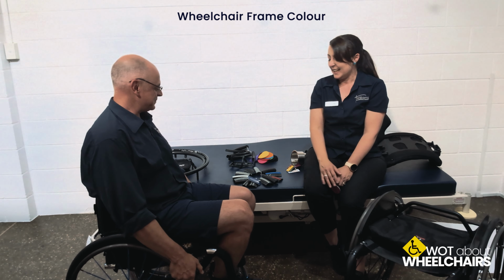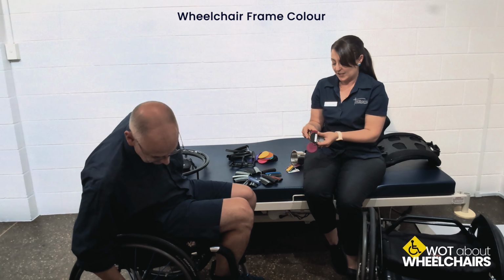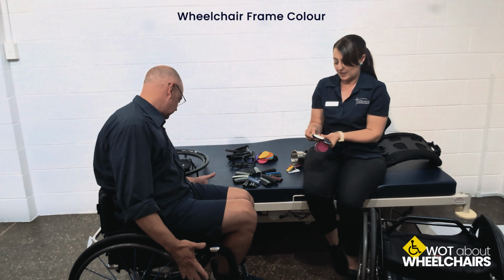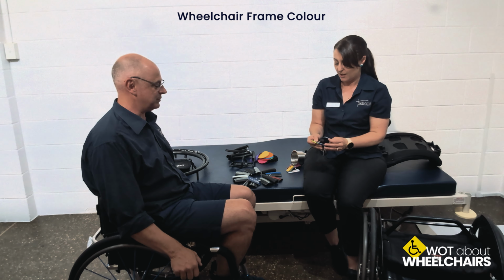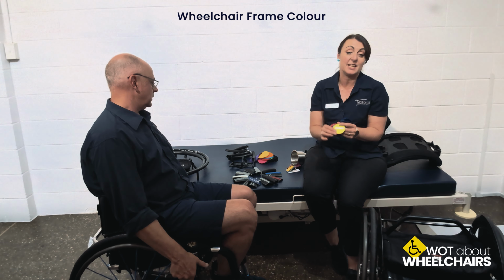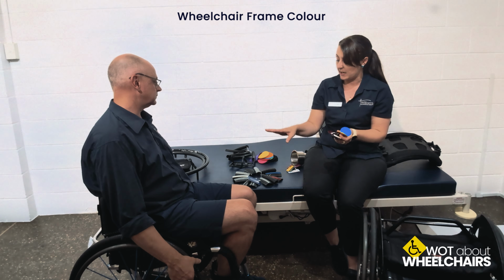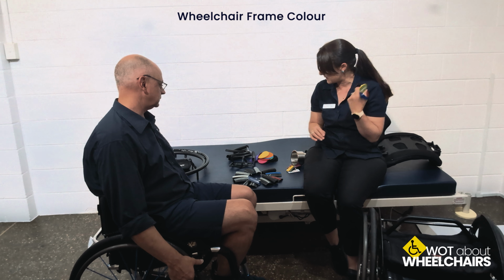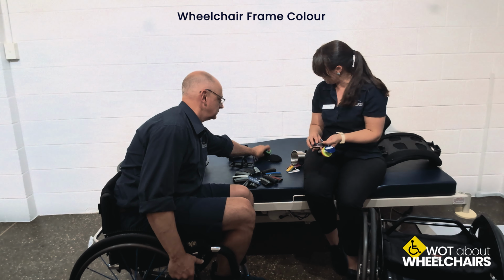But I'd go for a bit more of a navy blue if I really wanted it to match. But no, I like this colour scheme of chrome and blue, but it's not for everyone. So there are all sorts of different options. If you really want to stand out, if you particularly love green, there are all sorts of colours. Different wheelchair brands have different colour options. There's also some quite subtle colours as well if you prefer that.